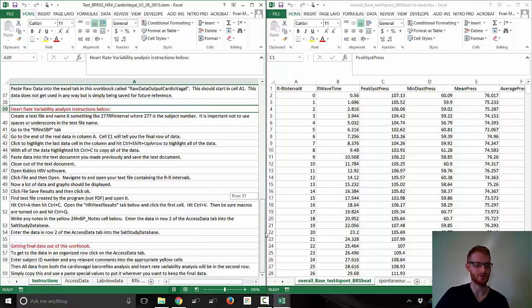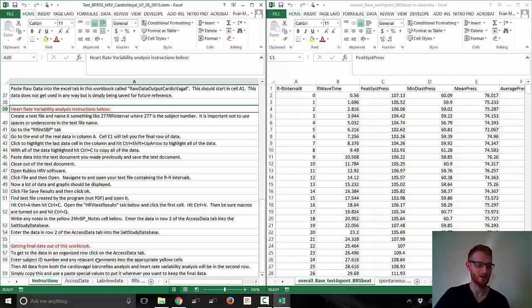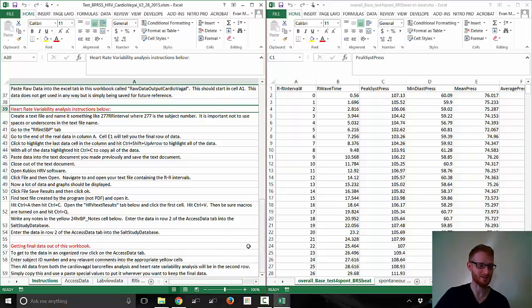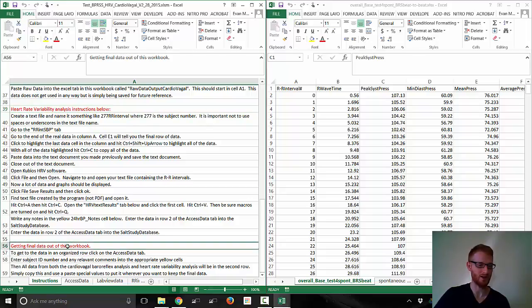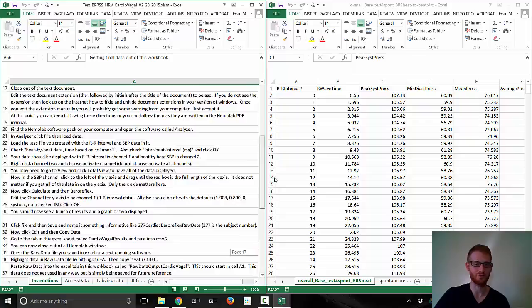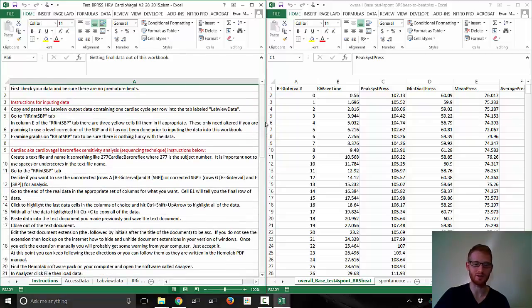I'll probably split this up into two videos — one for the cardiovagal baroreflex analysis, which I'll do now, and then another video for the heart rate variability analysis. This is a little time-consuming. Once you do it a handful of times it does get much faster, and this template does speed it up compared to doing all this manually. It's not difficult, it's just time-consuming, and you've got to do all the steps properly. In the end, we're going to get all the data in a single row, which will help put it into whatever Excel database or other database you're using to keep data for all your participants.